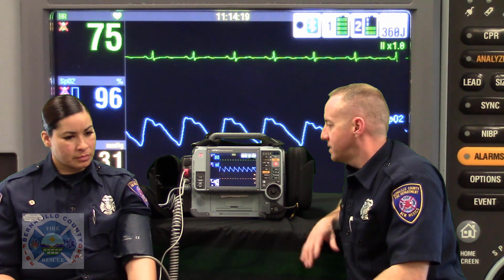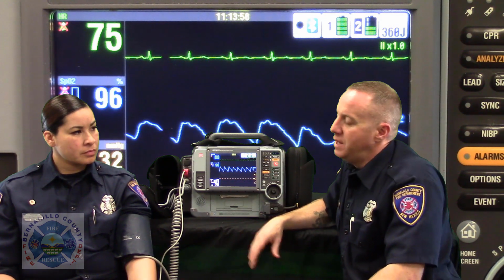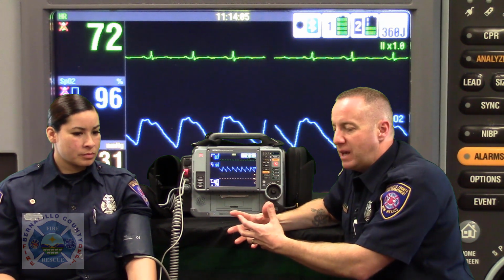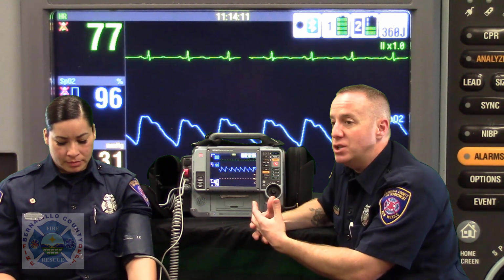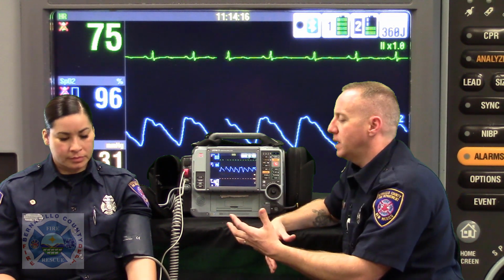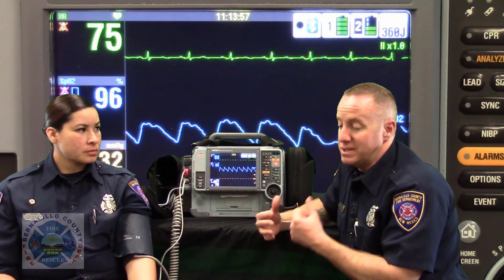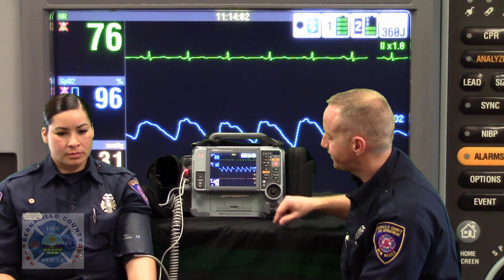Now, that being said, just because you affix an NIBP cuff on a machine to a patient doesn't mean that you don't have a responsibility to ensure that the cuff hasn't migrated, that it hasn't remained partially inflated, which would give you a bad reading, that the patient's condition has changed and you're missing it because the monitor didn't catch it and you as a clinician didn't catch it. So by employing this on any patient, it's still the provider's responsibility to practice due diligence and make sure that they're monitoring the patient's status, not just looking at a screen to give you the numbers that you're looking for.